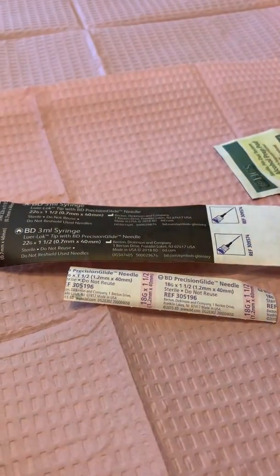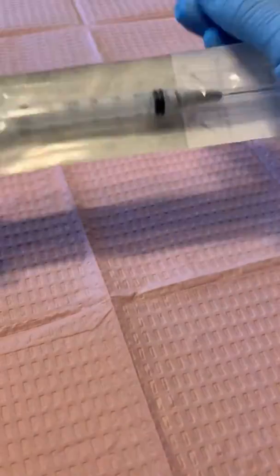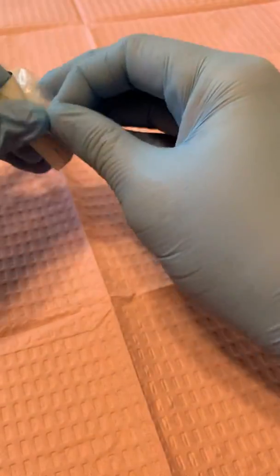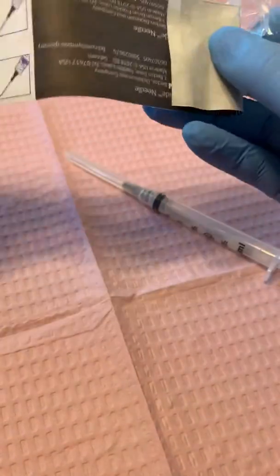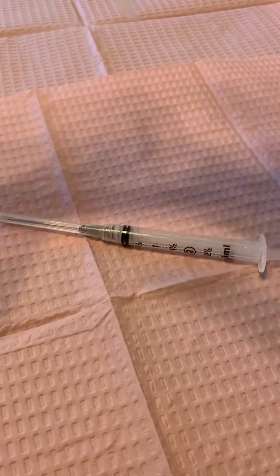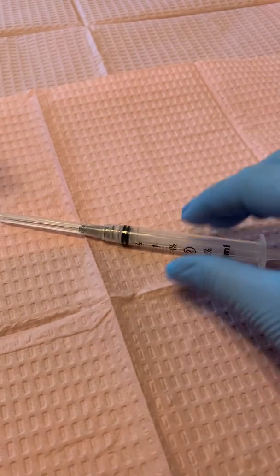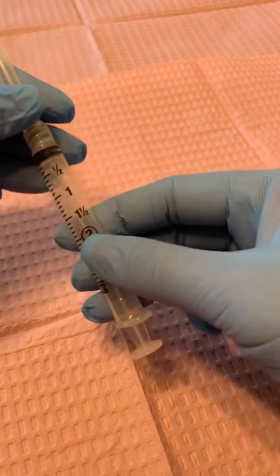I'm going to move this to the side while I open up my syringe. We're just going to peel it open and put it on my working surface here. If I were going to place it on a sterile field you could just drop it on there, but we're not working on a sterile field right now. Here is the syringe.